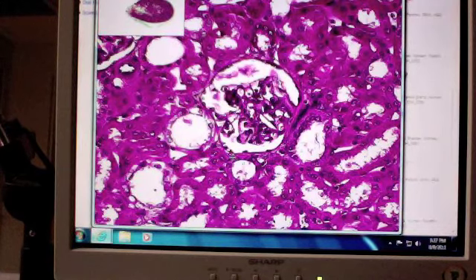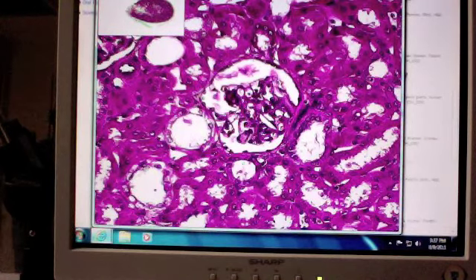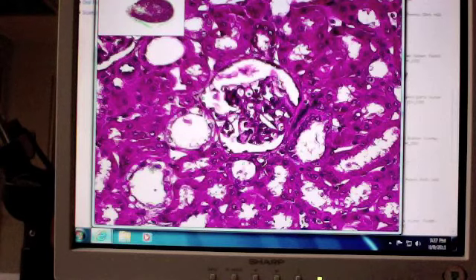We can immediately contrast that here to the next kind of simple epithelium, which is a simple cuboidal epithelium. And remember, with a simple cuboidal epithelium, the cells are approximately the same height as they are width. With that, you also would expect to see round nuclei. Okay? So when you start seeing these rounded nuclei, they no longer bulge into the luminal space. Let's take a look at this one, even though it's a little bit swung on the side here. You can see that these cells are about the same height as they are wide. So this here is a cuboidal epithelium.